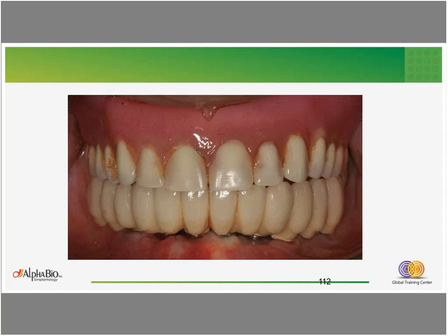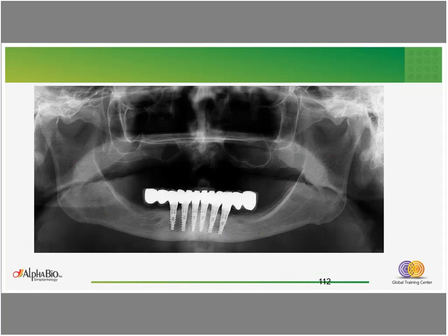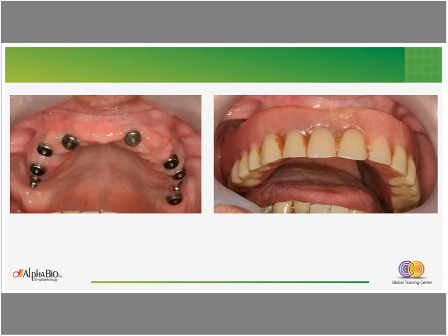When we have angulation and some tilting of the implants for restoration, we can use special multi-unit abutments. These are called angulated multi-unit abutments. This case was treated after the implants were integrated. We take an impression from the implant level.